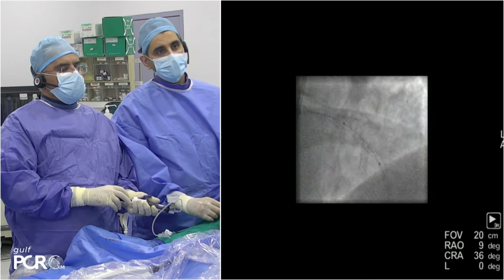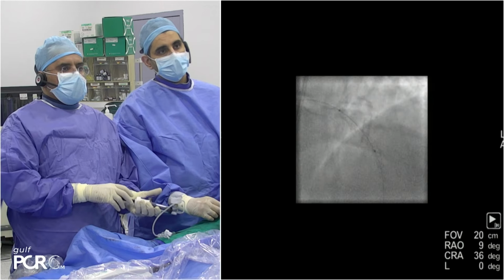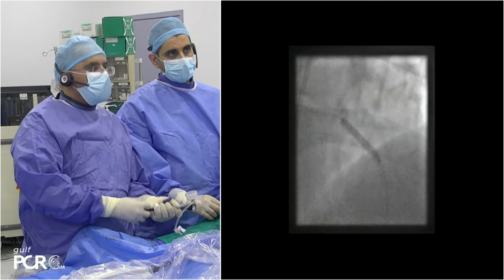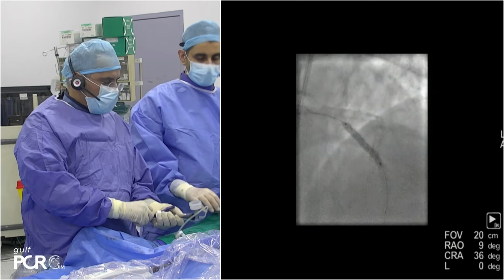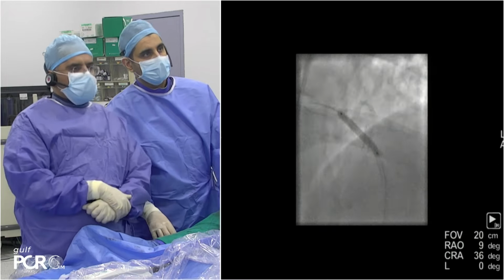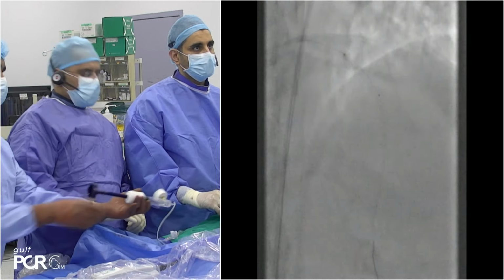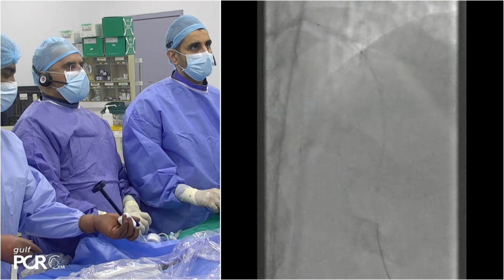What was the pressure with the 3.0? Okay, it's good. This is the 3.25 balloon. Which pressure? I'm going to 16 now. Okay. We'll take this out. We'll give you an angiography now. Go to the big screen.